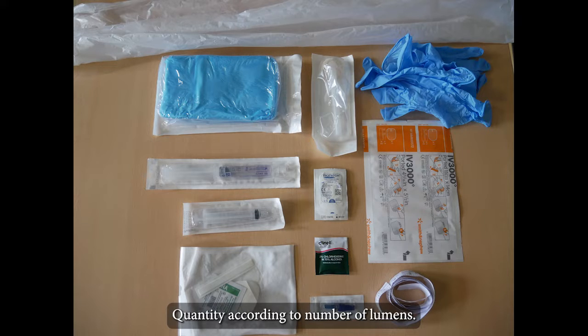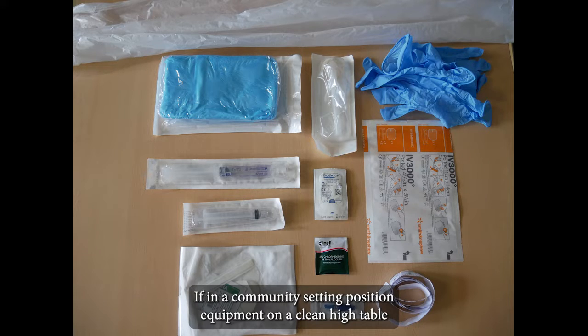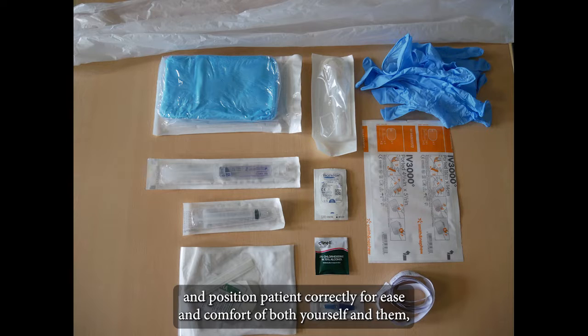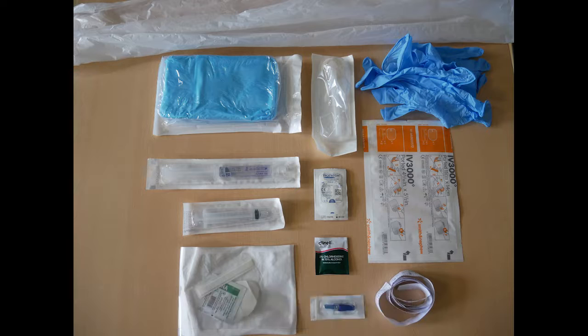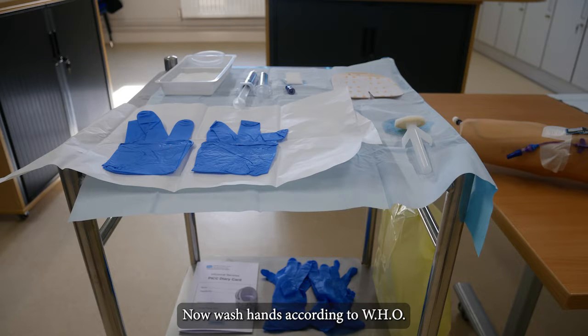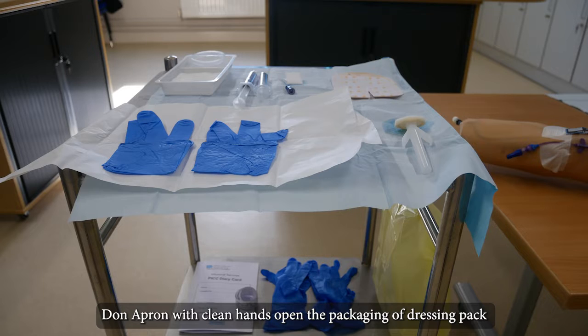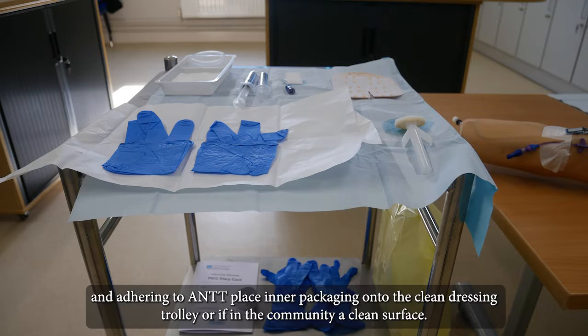Gather equipment quantity according to number of lumens. The following video is for a one-lumen PICC. If in a community setting, position equipment on a clean high table and position patient correctly for ease and comfort of both yourself and them. If in a hospital setting, use a clean dressing trolley and place all unopened equipment on the shelf below. Now wash hands according to the WHO seven-step approach. Don apron with clean hands, open the packaging of dressing pack, and adhering to ANTT, place inner packaging onto the clean dressing trolley.